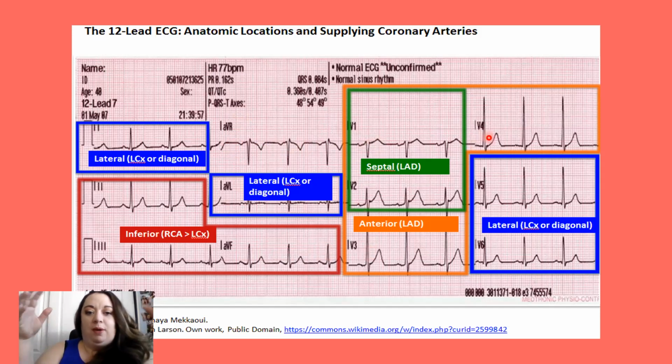When you look at the EKG paper, when I was new, I'd look at the whole line like we usually do. This is all upward deflected, and all of a sudden now everything's upside down. And then this kind of goes back. And I'm like, what the heck is going on with this line? So I do want you to know, when you're looking at a 12 lead printout like this, they're small sections of each area. And most of the time now they do have one long line at the bottom that is lead 2, because that's what we look at the most.